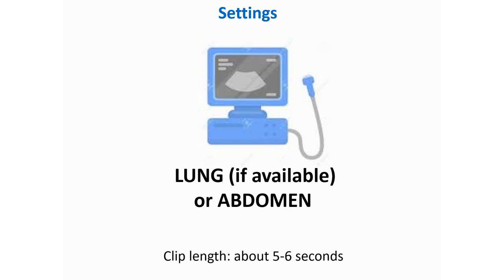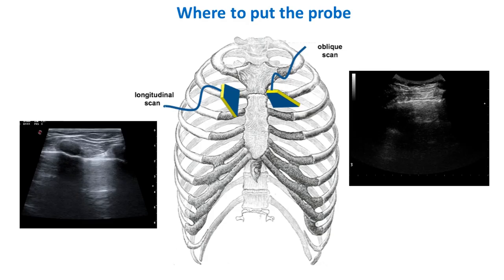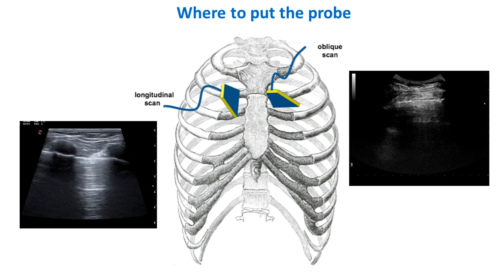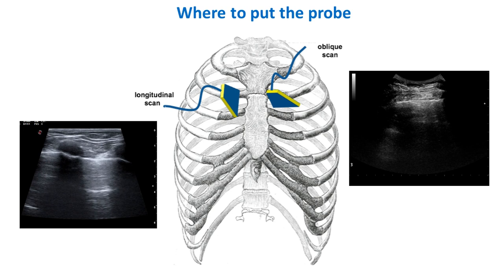You should scan each point for the duration of at least one complete respiratory cycle, possibly five to six seconds. The probe can be positioned in either a longitudinal manner, perpendicular to the ribs, or transverse, parallel to the ribs. In this video we will show the transverse approach, which avoids the interference of the ribs.